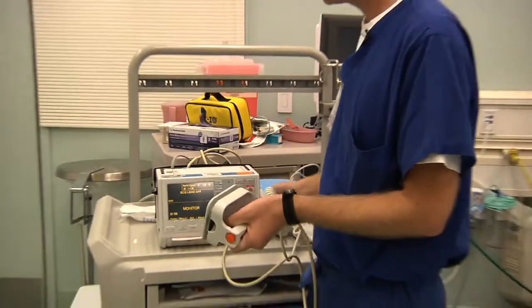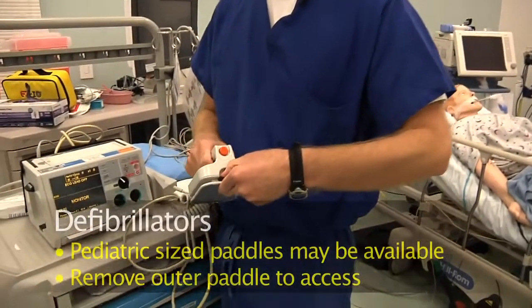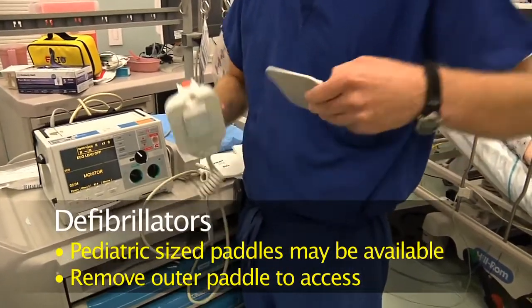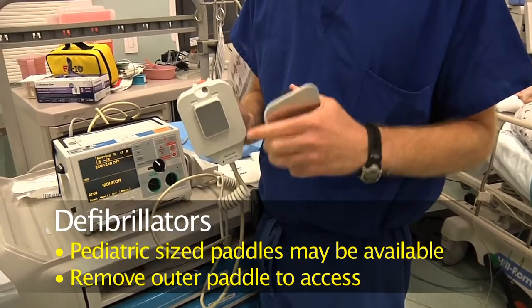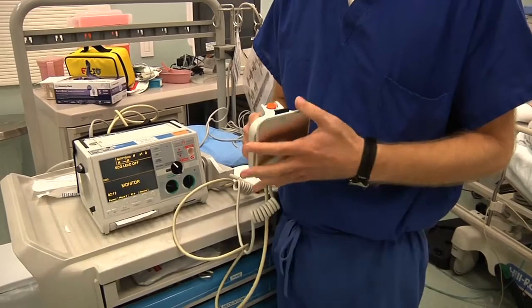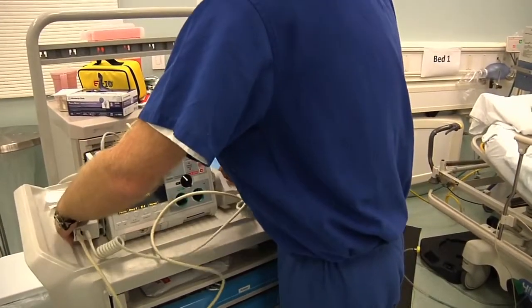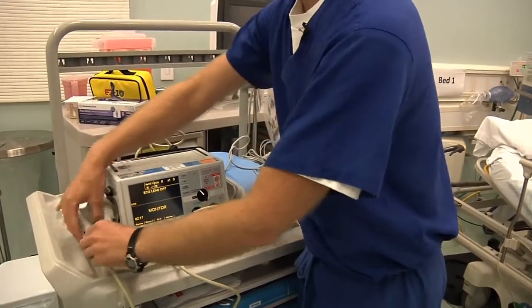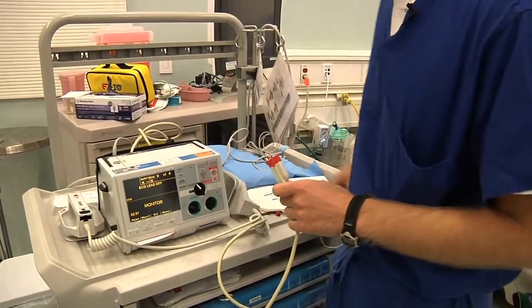One interesting thing to note about these: if you want to downsize these for a pediatric patient, all you have to do is pull it off, and you notice they're smaller. Most of these paddles are able to be downsized in this way. Once again, check with your own manufacturer to know for sure. So once again, let's go over the preferred way. I'm going to remove this. I'm going to put it back in.